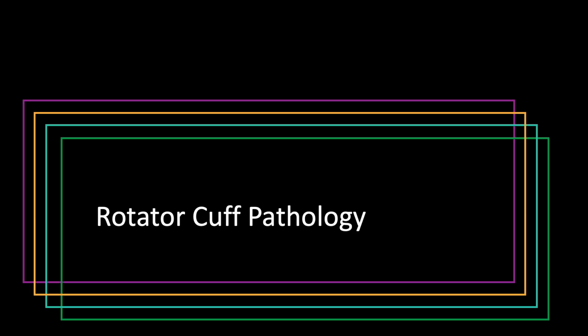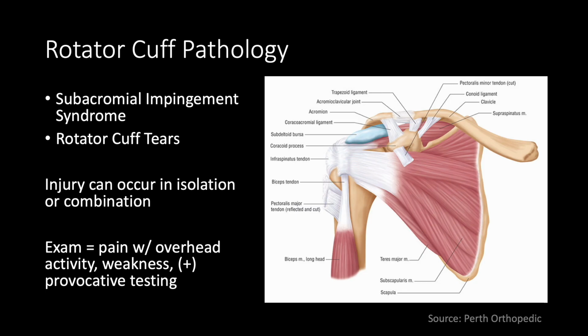Next, let's turn our attention to the big hitter in terms of shoulder pathology and look at the rotator cuff. So rotator cuff pathology exists on a spectrum from mild cases of impingement syndrome to severe debilitating pain or even rupture of the rotator cuff tendons. Clinically, patients will often complain of anterolateral pain, but their symptoms can be posterior if the teres minor or the infraspinatus are involved, especially if the pain is generated with external rotation.